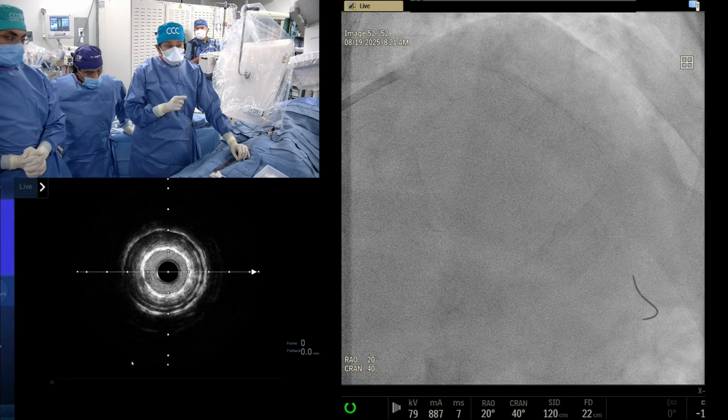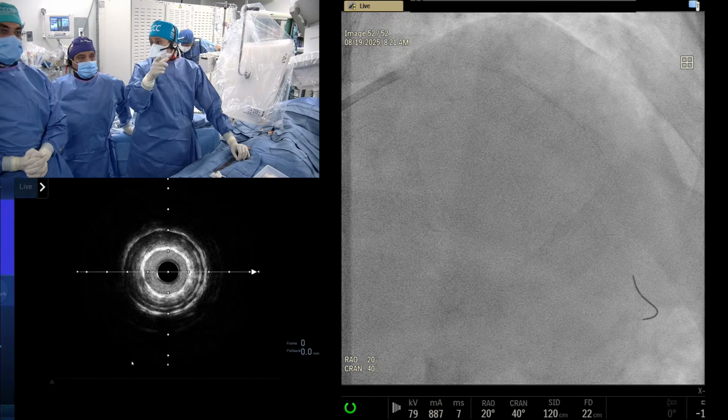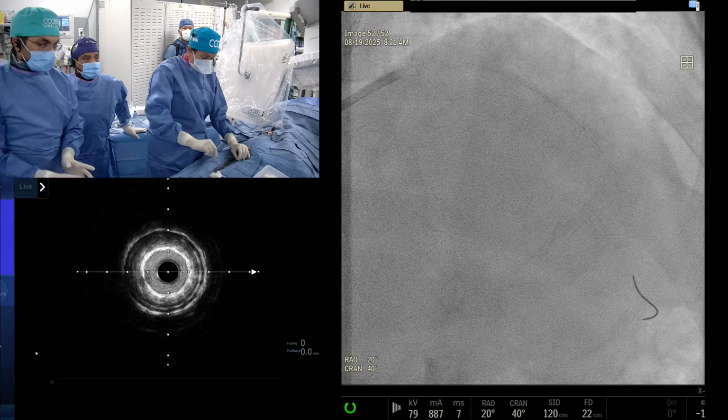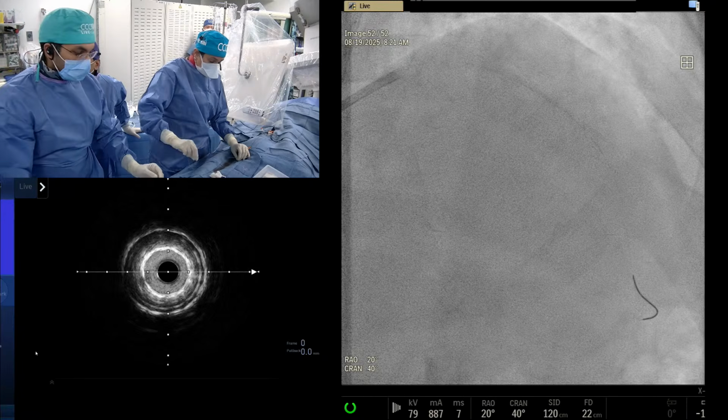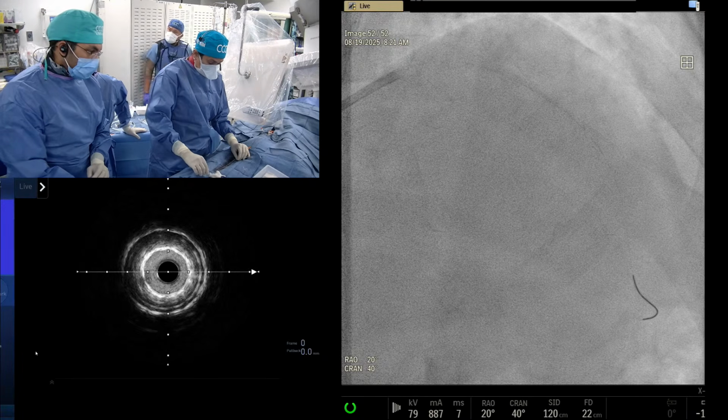No, it's significant disease. That's what it is. It's a lot of plaque. Go back to that. It is a lot of plaque, significant disease. That's why the IVUS is not going. So you didn't say cross with the calcium itself. We didn't record anything.